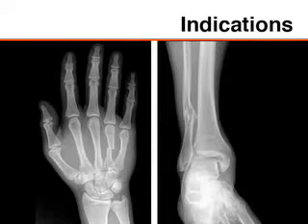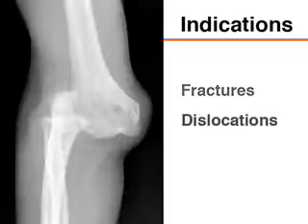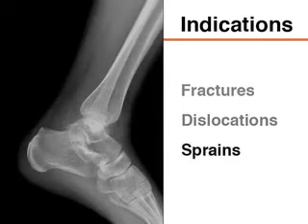While there are many indications for splinting an extremity, 3 main types of injuries are commonly treated in outpatient settings. Fractures. Splinting is used to stabilize fractures of the upper and lower extremity, providing patient comfort and maintaining proper bone alignment. Dislocations. After reduction of a dislocated joint, splinting is used to maintain anatomic reduction during healing. Sprains. Splinting may be used to maintain the position of function and to alleviate pain for patients with ligamentous sprains.